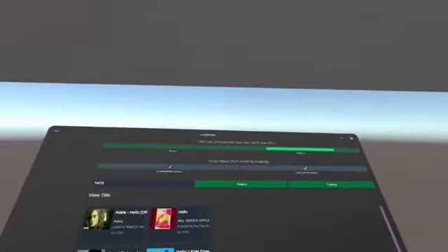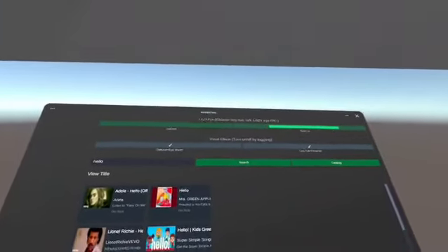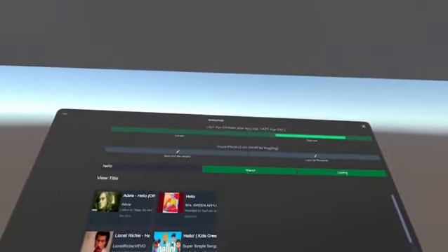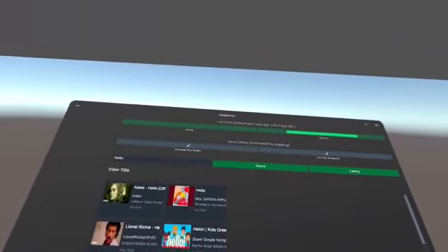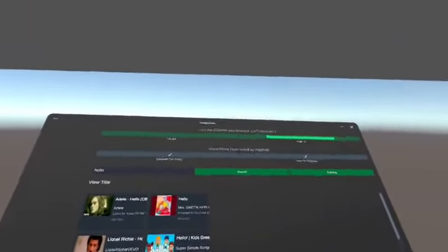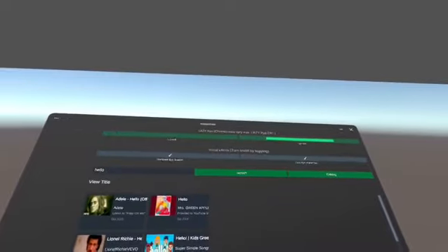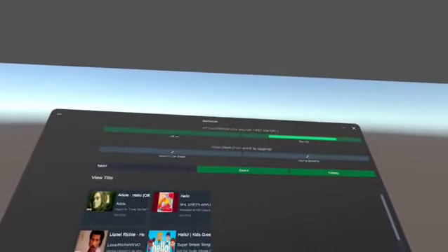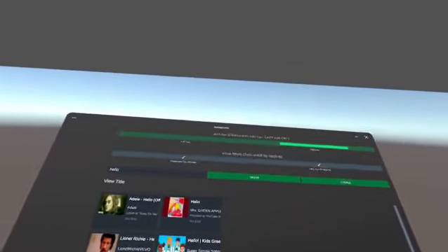The problem with the red and blue glasses therapy is that making the environment is very difficult. It takes some time, but here YouTube is your environment. Any object in YouTube, you can just sharpen it and you can add a flicker to it, so your lazy eye just starts seeing it in a better way, and that's it. You have to train your lazy eye, and that is very important.